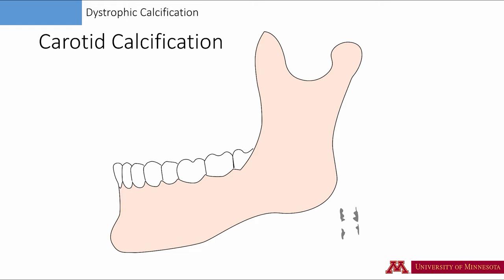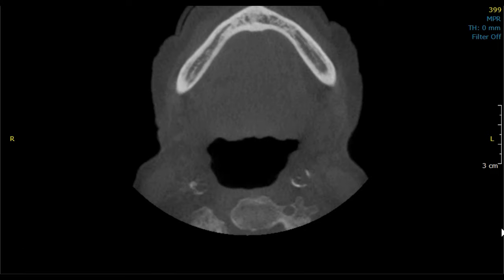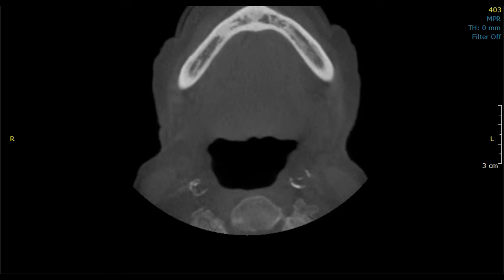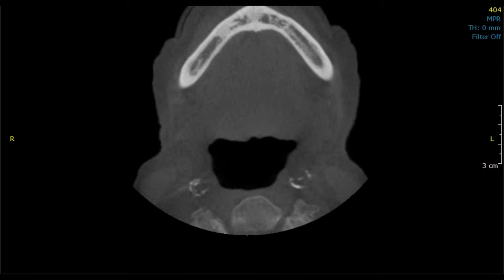Let's review a CBCT scan, paying attention to the axial slices. On the axial slices, we will see the circular appearance of the vessel. Looking at this axial view, here is the left calcified carotid atheroma and here is the right side. Let's scroll through these images to see the circular appearance of the vessel.